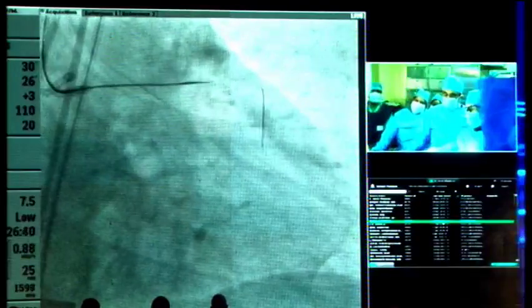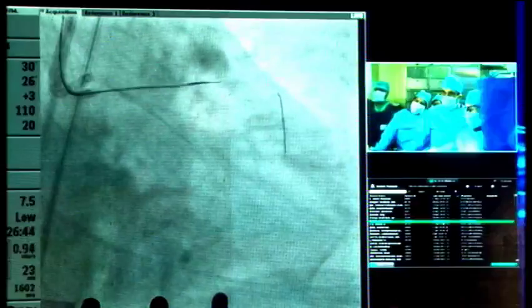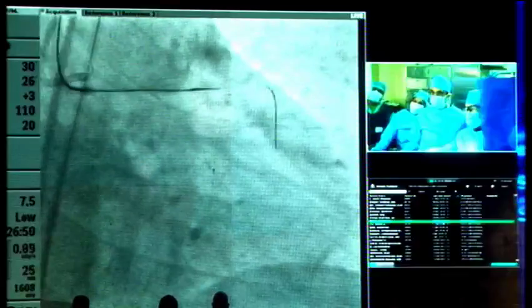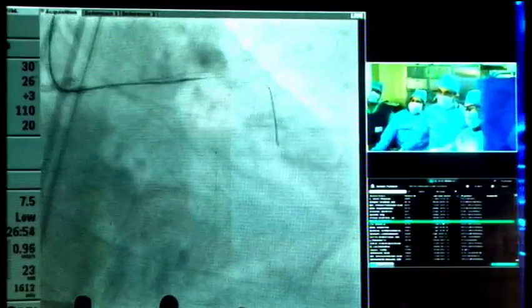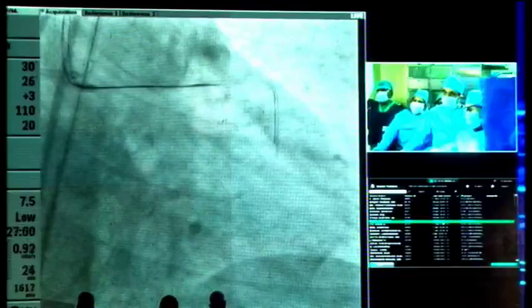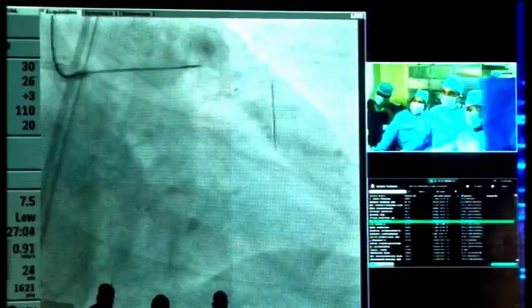I think, Surya, we'll go to the lectures. Yeah, you can go to the lecture and come back. Yeah. We'll come back with the results, and I think you have wonderfully crossed the lesion, probably via the septal artery. Now the work is very simple for you. I think we'll go to the direct lectures, and the first lecture will be by. Sure. Yeah, please go ahead.